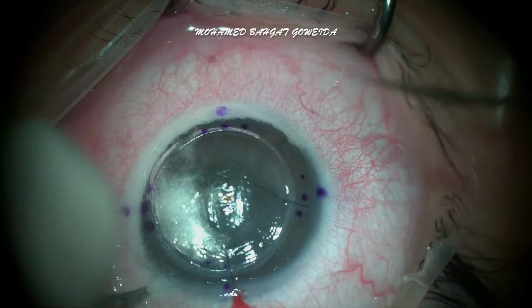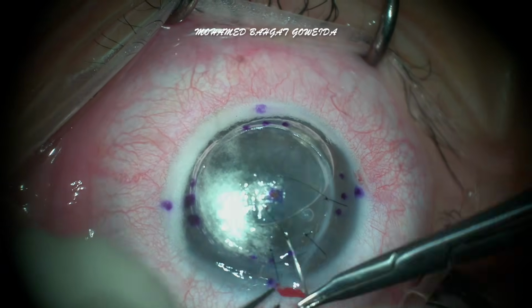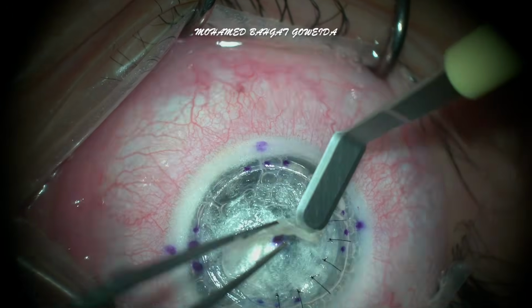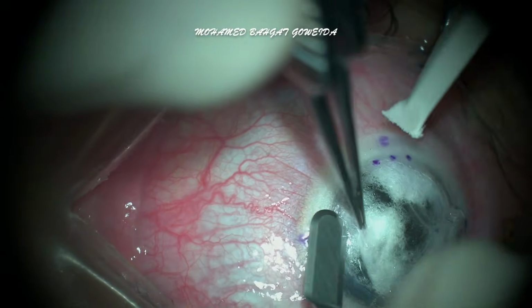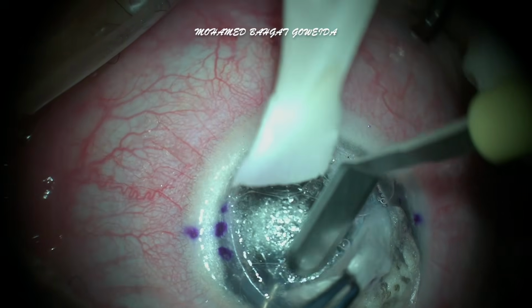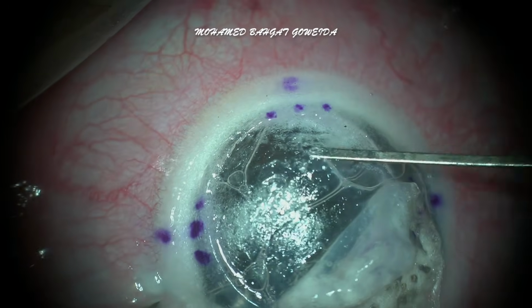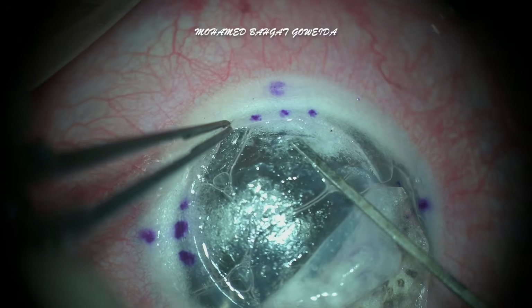More suture was then added, followed by careful removal of 2 layers of the anterior stroma. The key at this stage is not to chase the perforation. Instead, I start dissection away from the perforated area and progressively deepen the stromal dissection under direct visualization, leaving the dissected part reflected over the perforation to seal the perforated part.